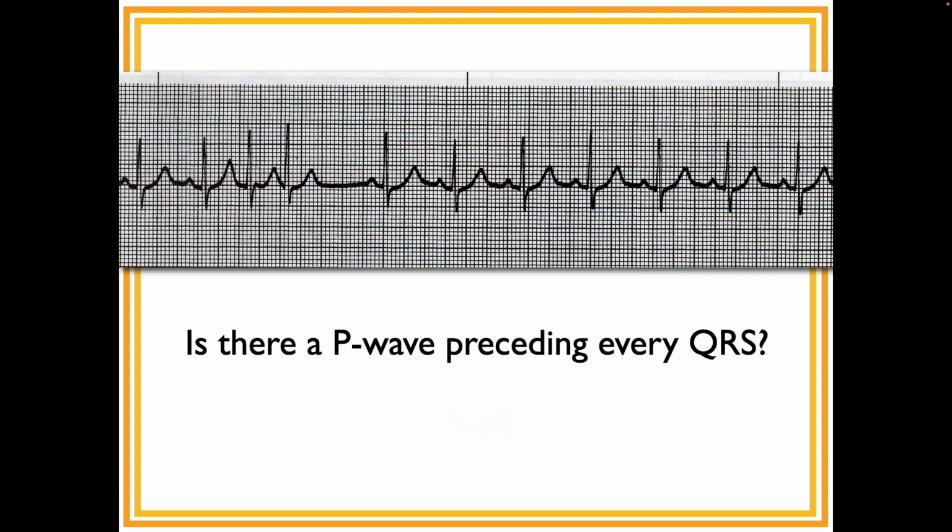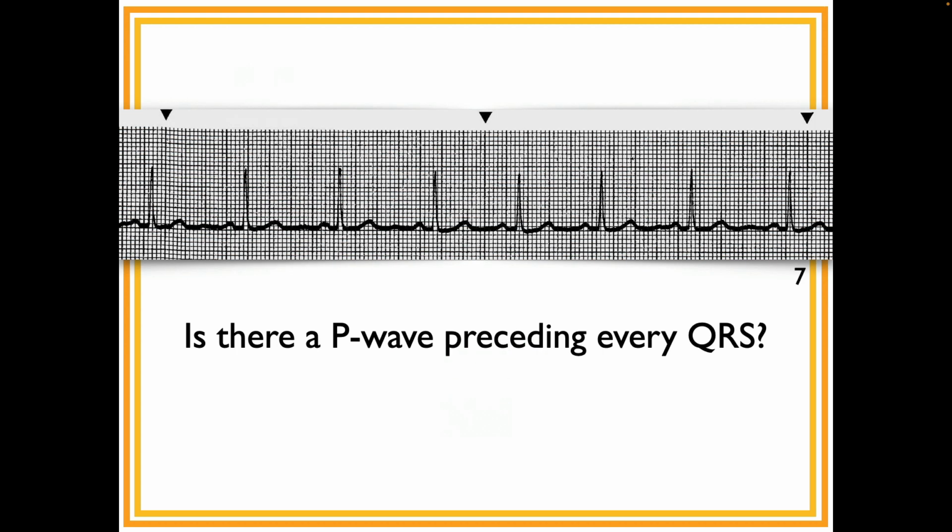wave. The other answer is that while there are plenty of reasons why an individual P wave might be absent, there's a bunch of reasons for that, I can think of no reason why an individual T wave might be absent, meaning if it's going to be there, it's going to be there all the way across.